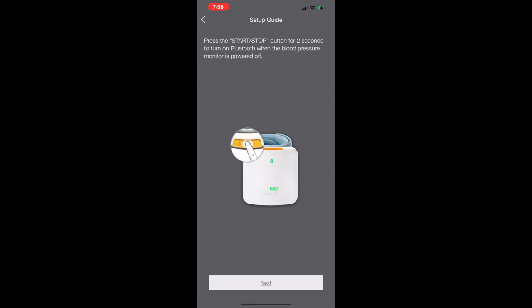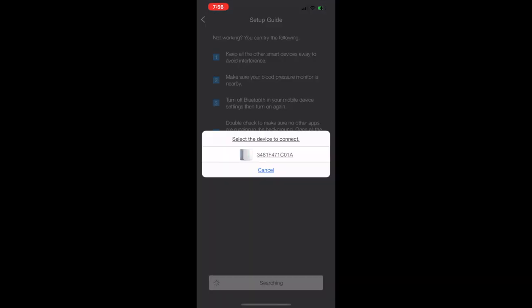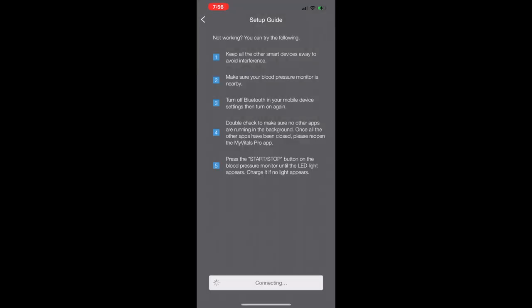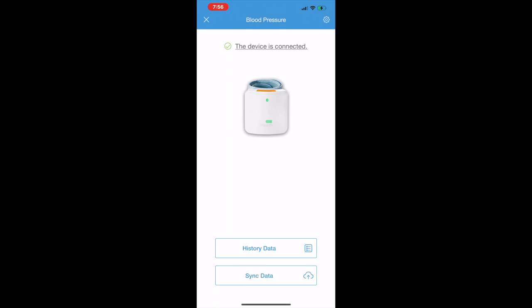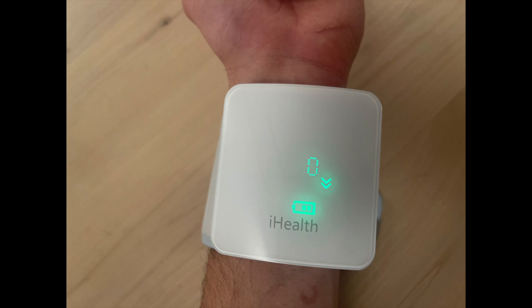Follow the instructions on screen, and then hold the start stop button on the monitor while it's turned off for 2 seconds to activate pairing mode. The display will show a Bluetooth and battery icon in green to indicate that you're in this mode. After doing this, select the device serial number when it appears on your screen, and this will now successfully pair your device. Once the device is paired, you should see it on the homepage of your iHealth My Vitals Pro app. Now that your device is charged and paired with iHealth, you're ready to take a measurement.